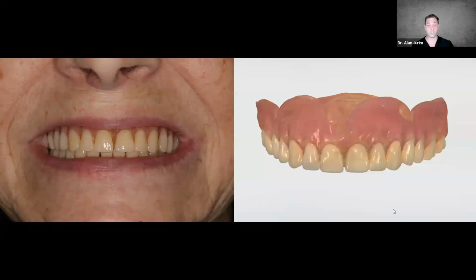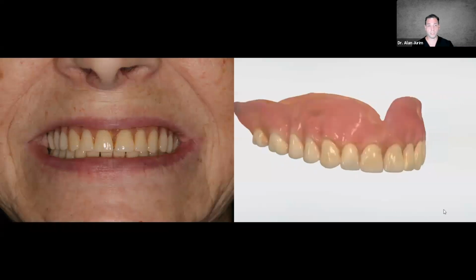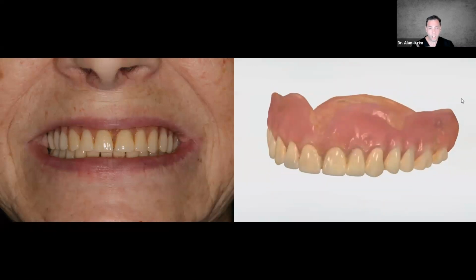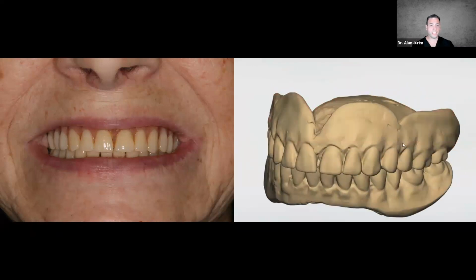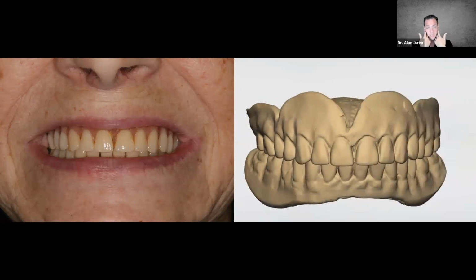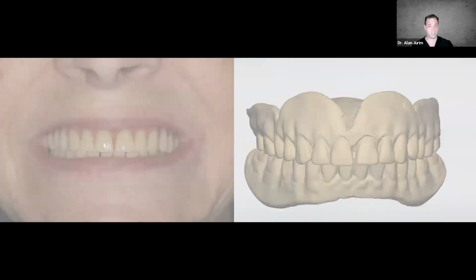One visit actually being the treatment plan visit, and the second visit being the visit where we're going to gain a little bit more of our records. So what do we do in a case like this? Well, we actually Trios scan the complete denture. Because the patient already knows, and we know, where the tooth setup should be, the process of scanning the denture, scanning the lower, and then scanning the relationship of the dentures in the mouth gives us this very important data set. And once we have the scan, we're able to very efficiently, quickly, and easily take that and send it to the 3D printer.